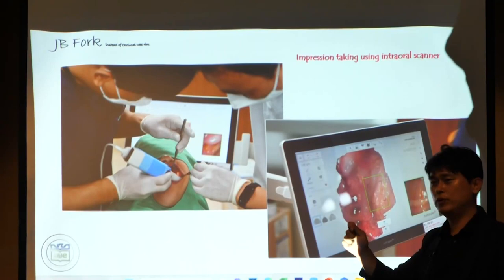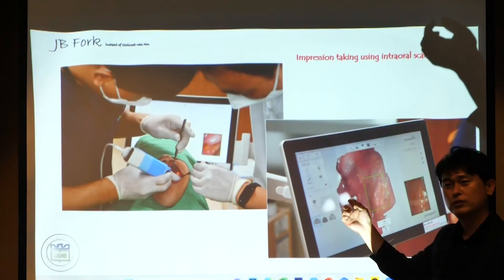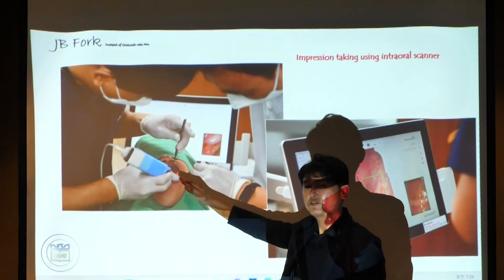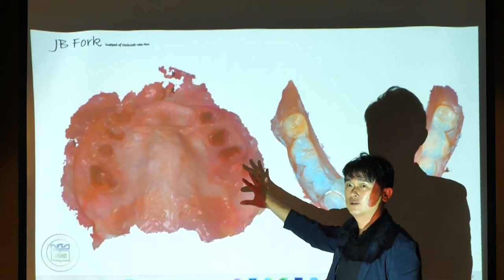First of all, you take an impression with alginate, and then scan the alginate inner surface with the intraoral scanner. That is the method to reduce the delivery of the cast to the dental technician. Anyway, I like to scan directly. Scan the upper tooth and the lower tooth like this. To get those kinds of impressions, you need some experience. You exercise. You need practice.